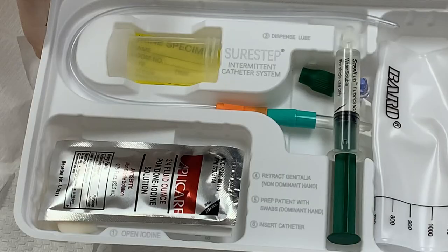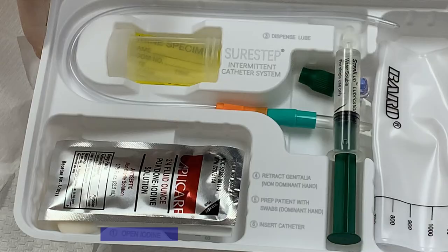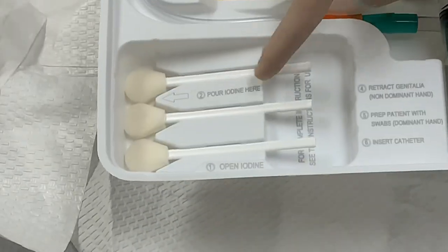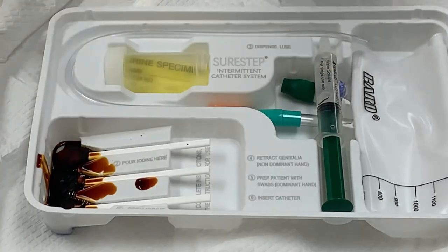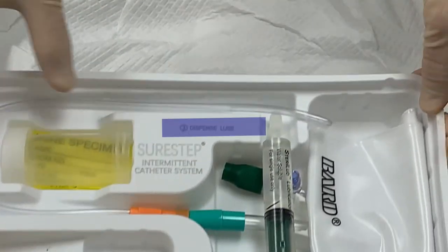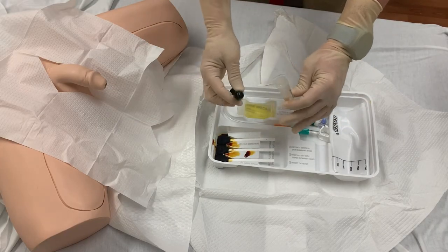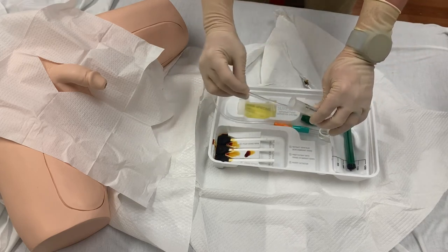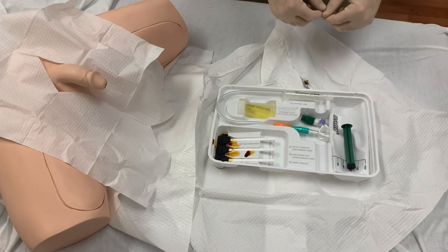With the drapes in place, the rest of the items of the kit are now visible. On the tray you will see numbered steps to insertion — follow these steps in order. Step one: open the iodine. When you remove the iodine packet you see step two, which is to pour it on the provided swabs — do that now. Step three is to dispense the lubricant. You can use the syringe to apply lubricant directly to the tip of the catheter, but a preferred method is to remove the plunger from the back of the syringe and place the tip in the syringe itself. This helps keep the catheter contained and on the tray, because sometimes the rigid tubing will cause it to fall off the tray and out of the sterile field.